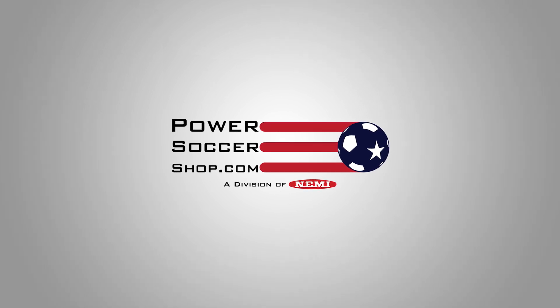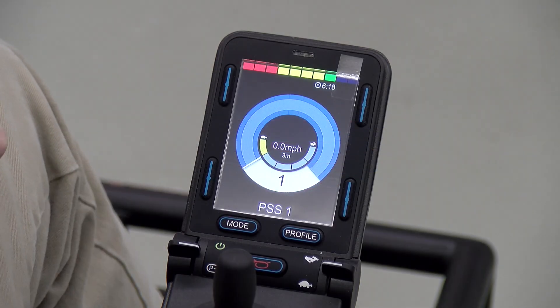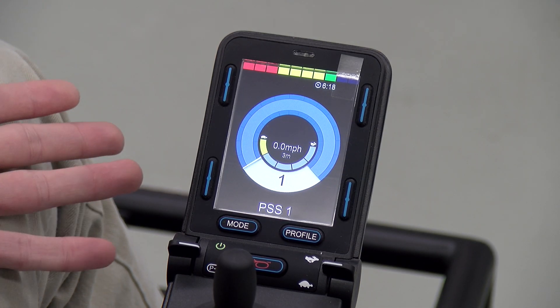Hey everyone and welcome back to another Power Soccer Shop tutorial. My name is Reed and today we're going to be looking at how to get into the onboard programming on the R-Net joysticks.